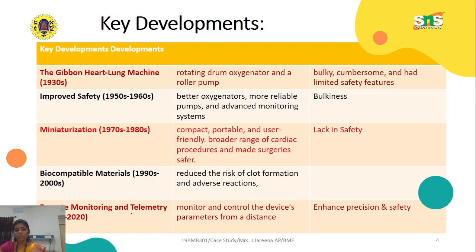And then we know technologies have been ruling the world day by day. So the heart lung machine and any medical device have now come into biotelemetry. That is, the patient will be at one end and the doctor at the other end.